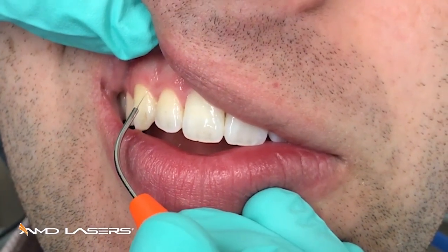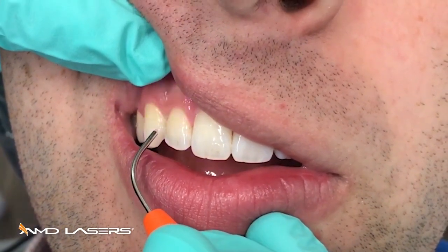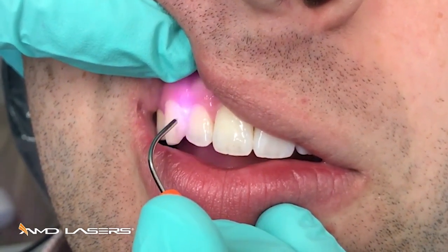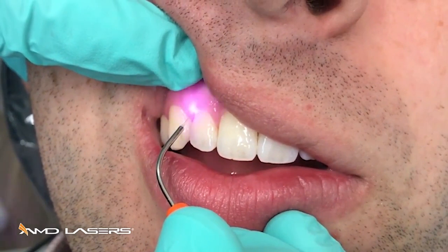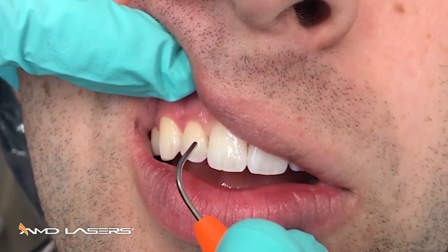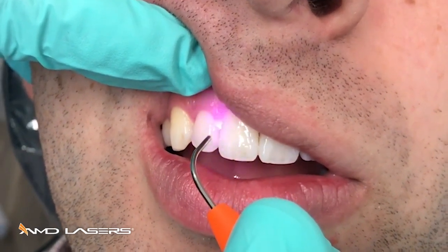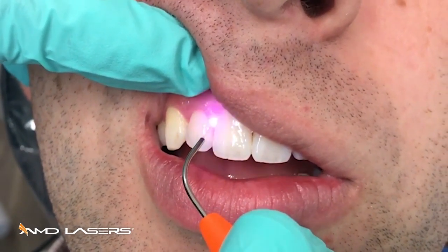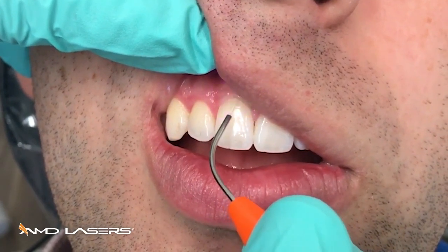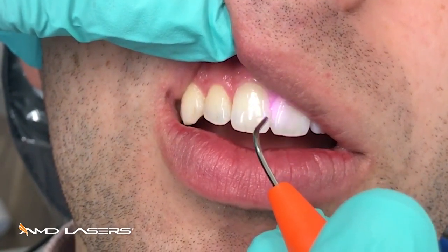Start moving the laser slowly and gently, not against the tooth and not against the tissue. Make sure you angle interproximally to reach the depth of the interproximal pockets. The therapeutic range is between 1 and 10 joules per centimeter squared. You achieve that dose by spending at least 10 seconds across each tooth, because the amount of tissue across one tooth and within the pocket is approximately a centimeter squared.